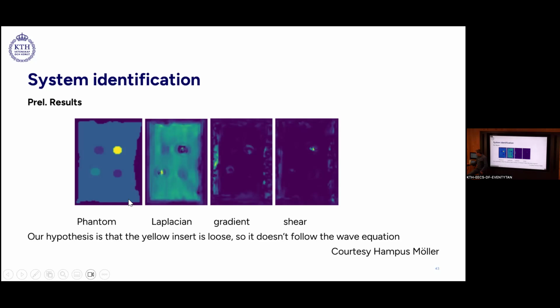Then we estimated the components of the PDE. If everything is correct, this Laplacian part should be the only component that is active. In a way, it's fine for more or less the whole phantom, except for this insert. We found that it's too dark here.